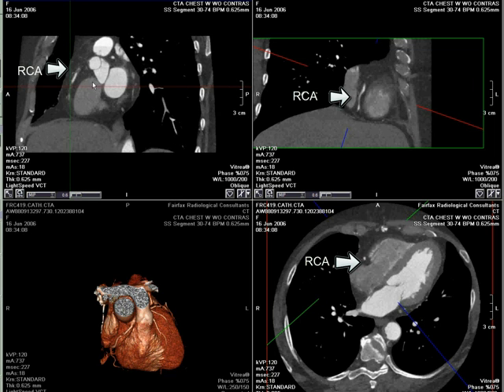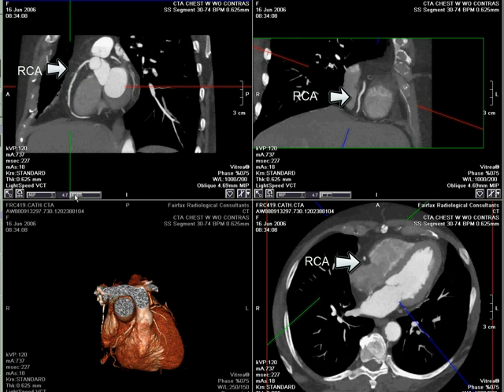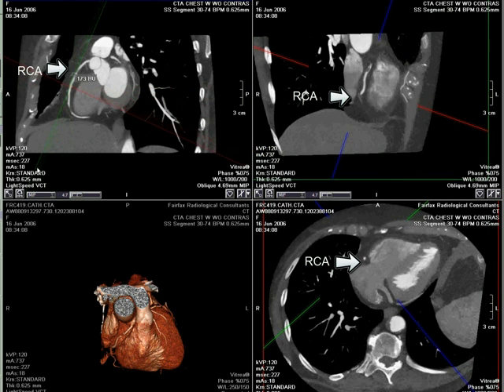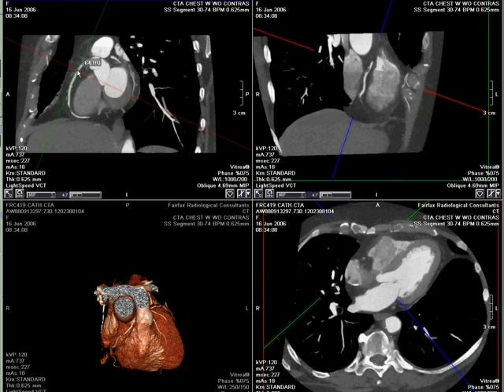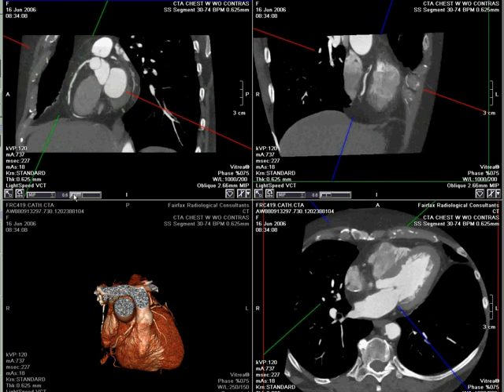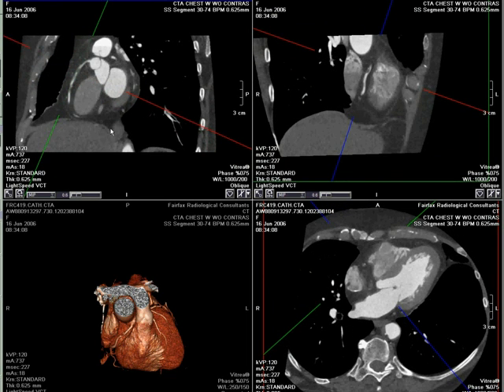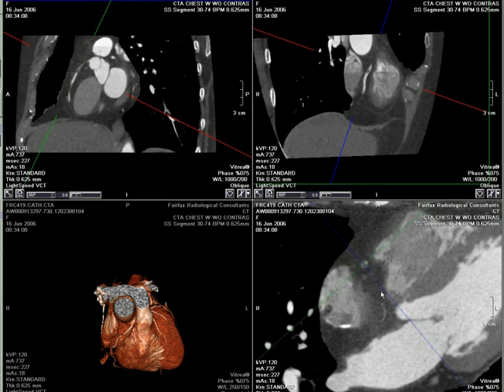With this, within the proximal right coronary artery, we find that area of non-calcified plaque. We need to evaluate how much, if any, narrowing this is causing in the vessel. Using a combination of our short axis and long axis views, we can tell that there is a significant area of narrowing.